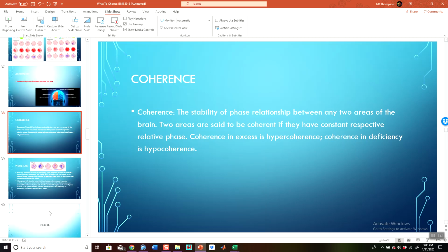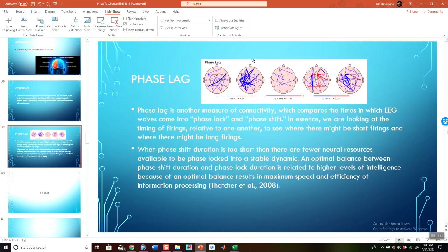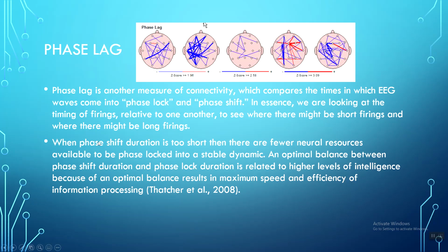So we've talked about coherence. Last but not least is phase lag. There's a lot of words on this slide, which is not my style. So take a second to read it, and then I'll start to talk.